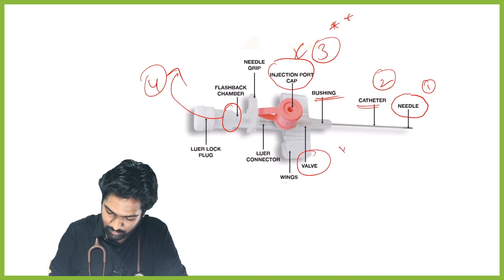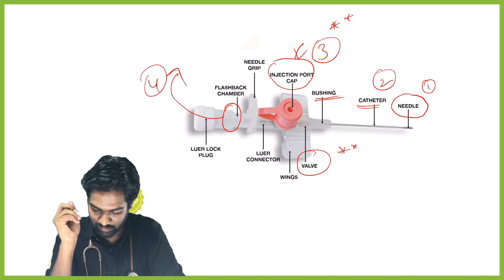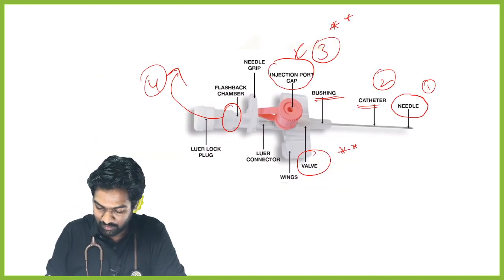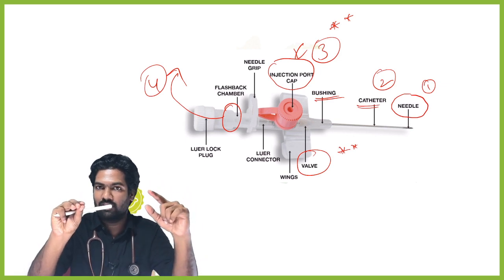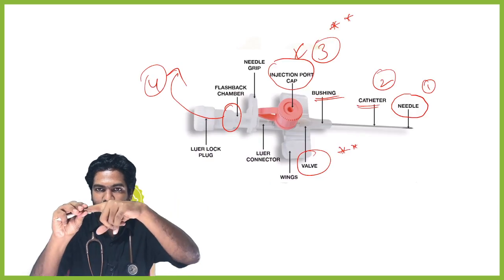Repeating the question where you asked about the valve. Now imagine, this is the valve. The moment you try to prick and remove the entire needle, it is like this. There is this needle, and the moment you remove it, the valve is as good as non-functional.